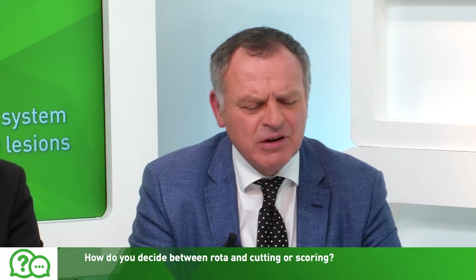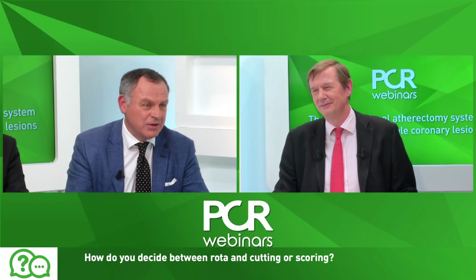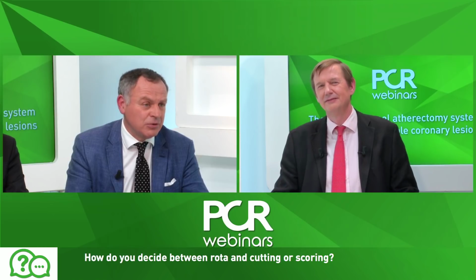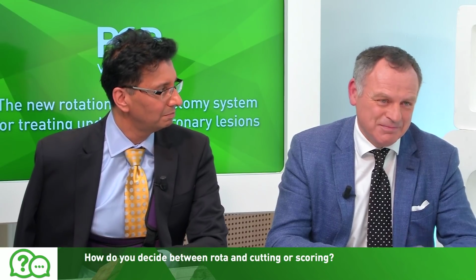I will say that in very long diffuse disease, most of the time the profile of this device is not sufficient to cross. The problem is that when you try the cutting balloon or the scoring balloon, it will not cross the lesion. So now I am moving directly to rotablation.